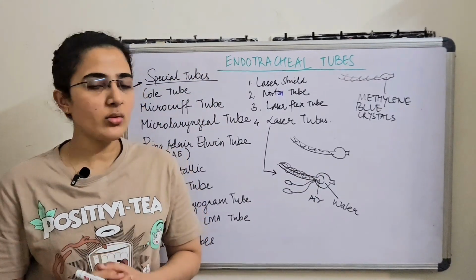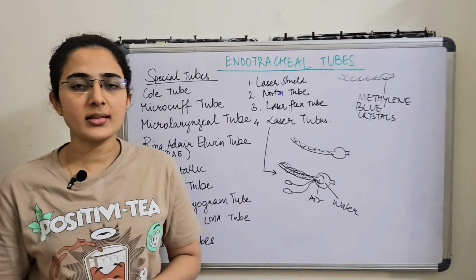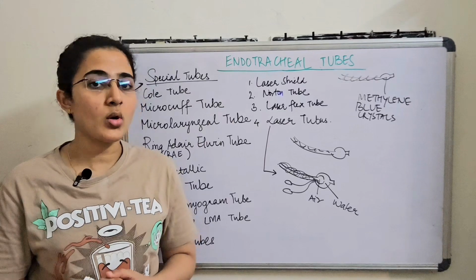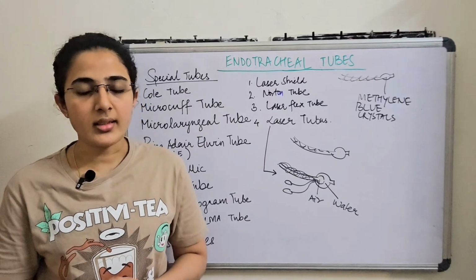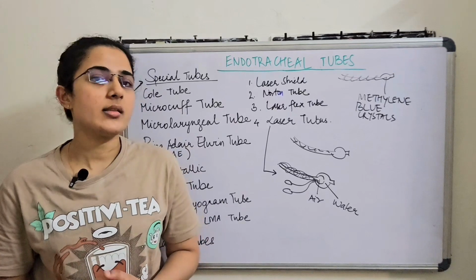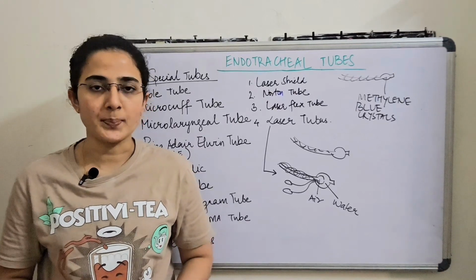So we have come to the end of this video, and we have discussed what an endotracheal tube is, its indications, the techniques, the parts in detail, and some basic features of these special tubes.